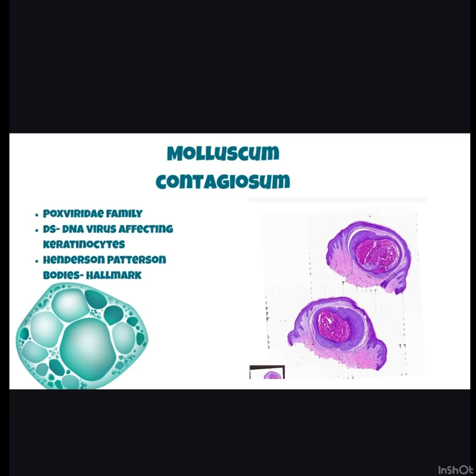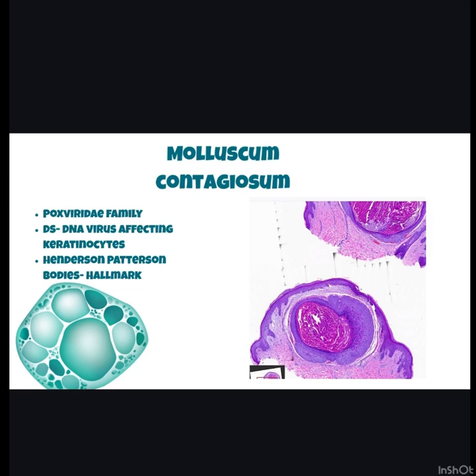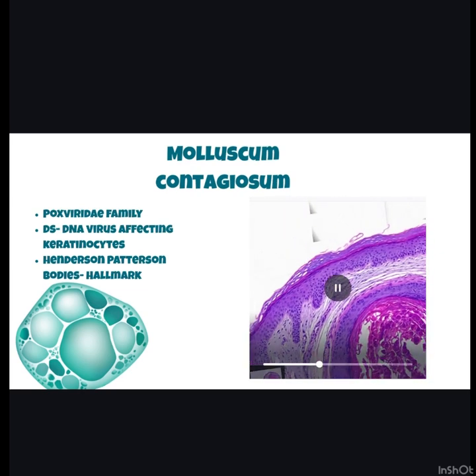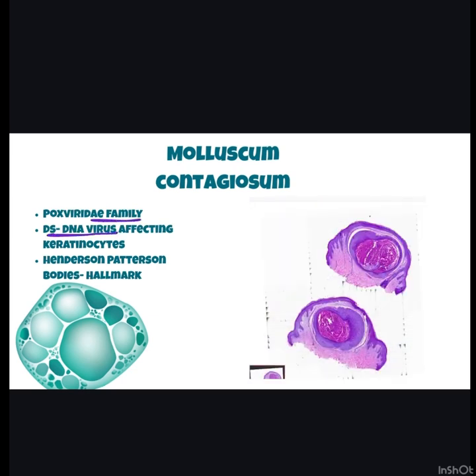So the next virus is molluscum contagiosum. Molluscum contagiosum is from the Poxviridae family. So they are double-stranded DNA viruses which affect the keratinocyte, and the hallmark is Henderson-Patterson bodies. So let us now move on to this video.